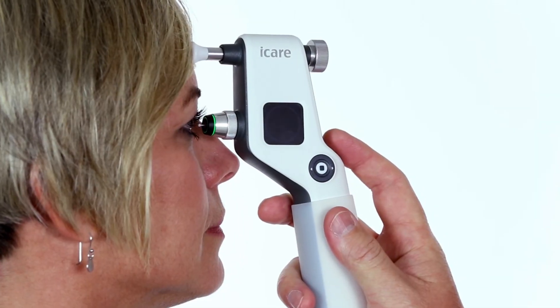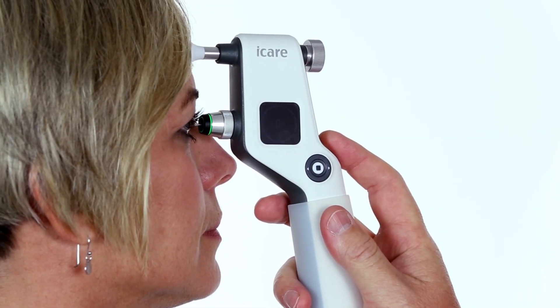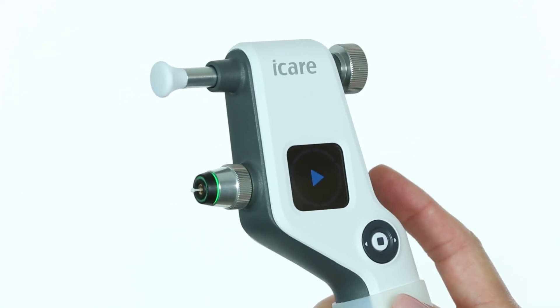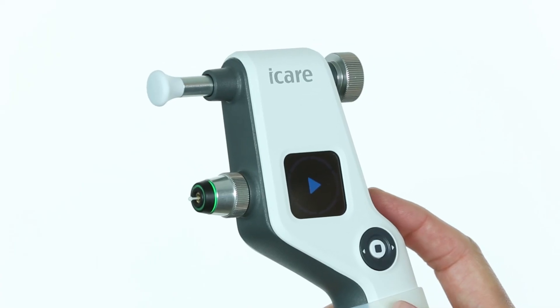For example, if you are too close to the cornea, the too-near error message will display, and the probe base light flashes red. Clear the error message by pressing the measure button once.